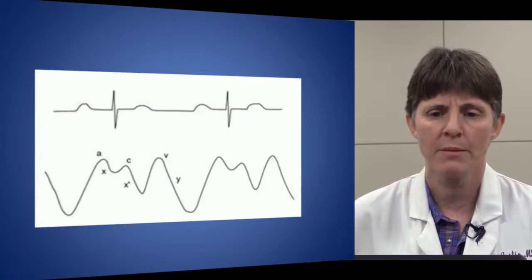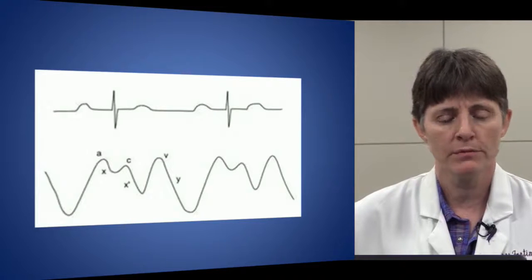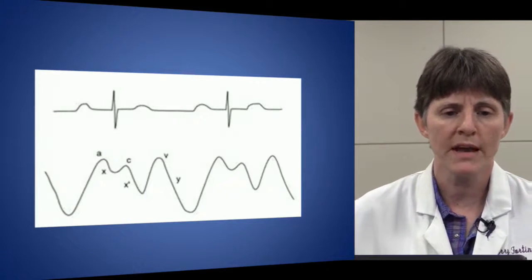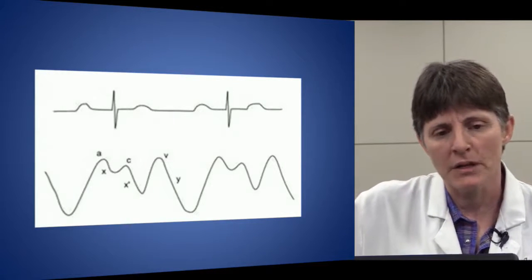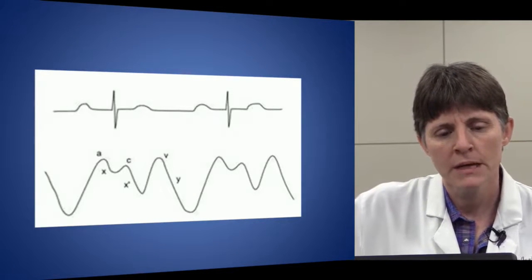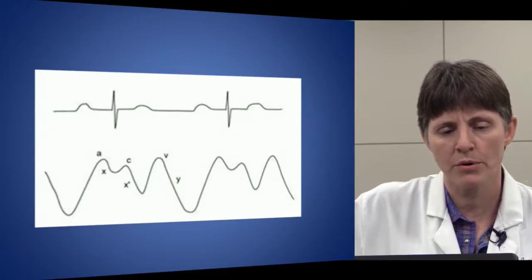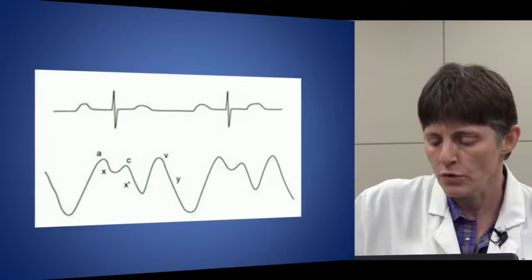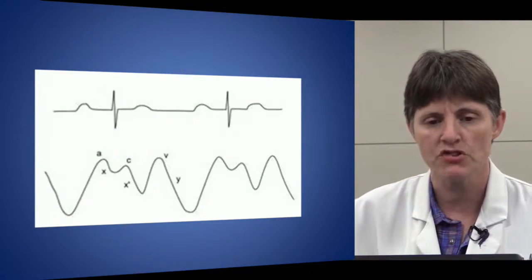At the top is an EKG, and the A wave should go with atrial contraction. So there's a little P wave in the EKG, and that goes with atrial contraction. Electrical activity then occurs, which should start off systole, and then the V wave follows that QRS complex, and it comes almost at the end of the T wave. So if you're trying to sort out what's an A and a V wave, you need to time it with an EKG.